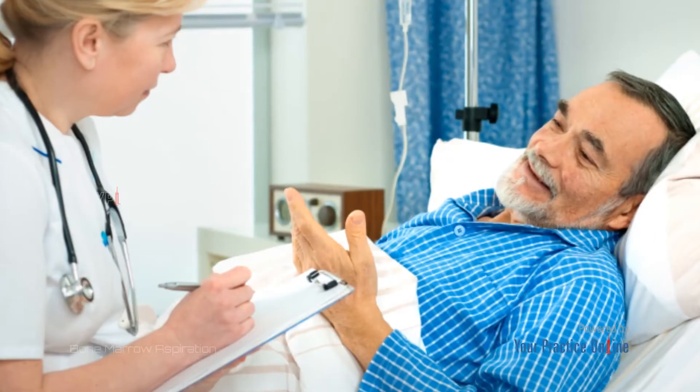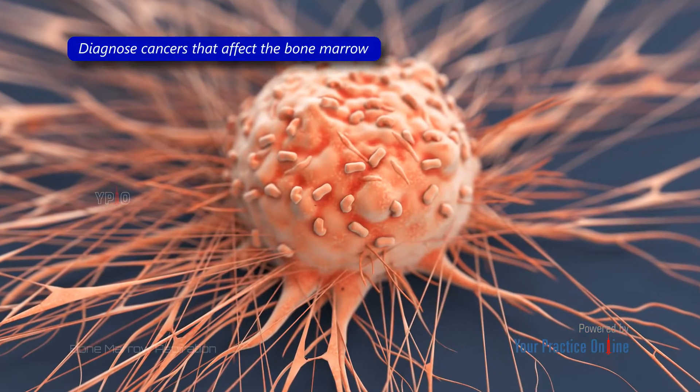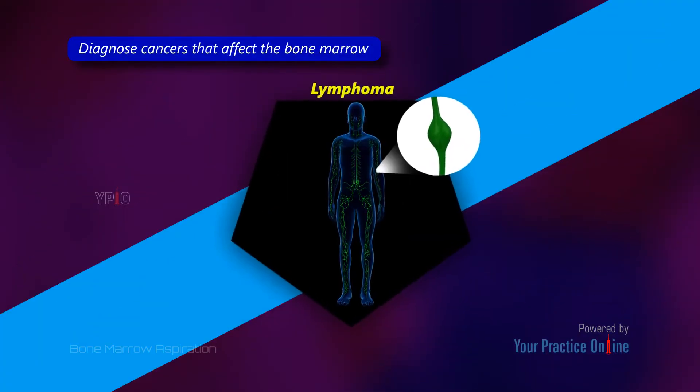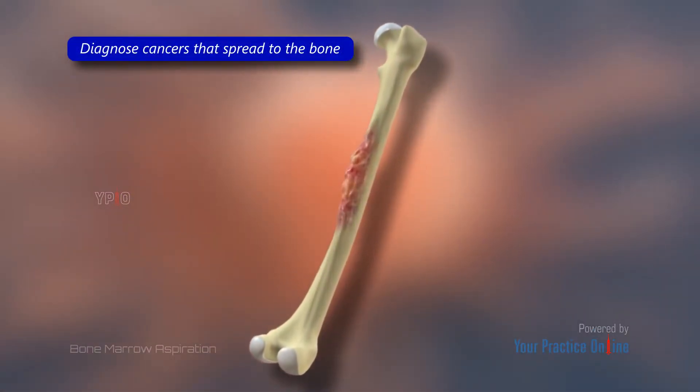Bone marrow aspiration may be ordered by your doctor to diagnose cancers that affect the bone marrow, such as leukemia, lymphoma, and multiple myeloma, as well as to diagnose cancers that have spread to the bone from other parts of the body.